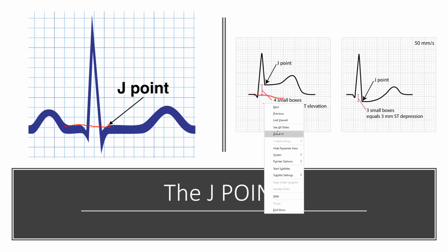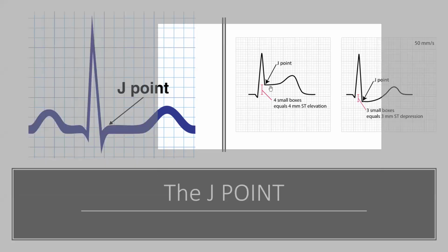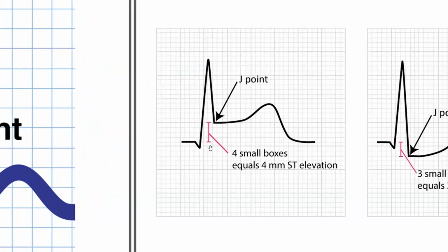Now, in addition to looking at or appreciating that there is an ST elevation, we need to determine whether or not this ST elevation is significant. This is the reason why we need to measure how much deviation from the baseline it is going to be. So if I'm going to amplify this particular image right over here, the ST elevation, how many boxes is it elevated from the baseline?